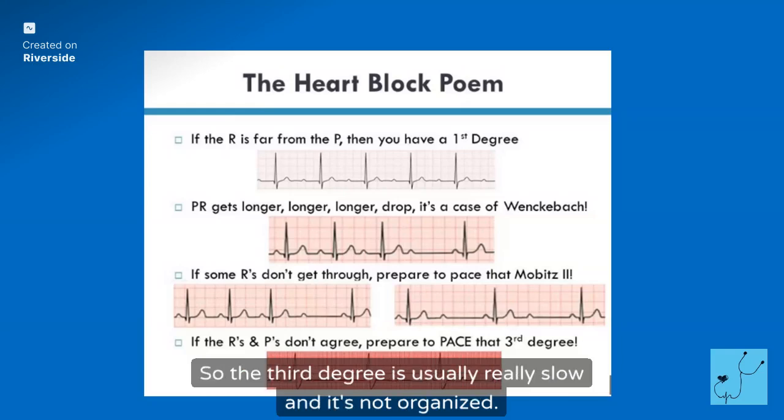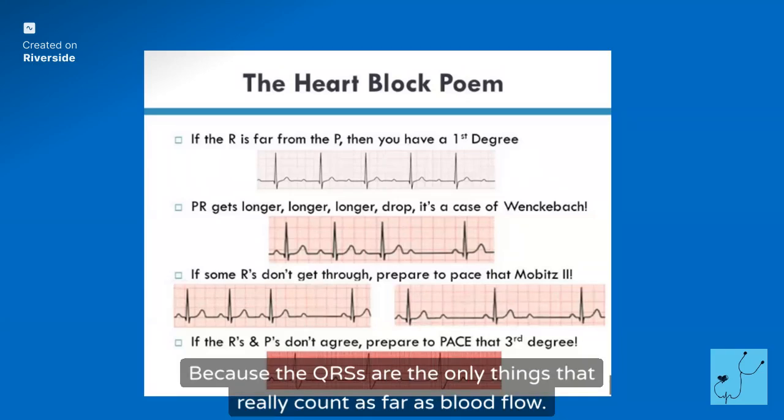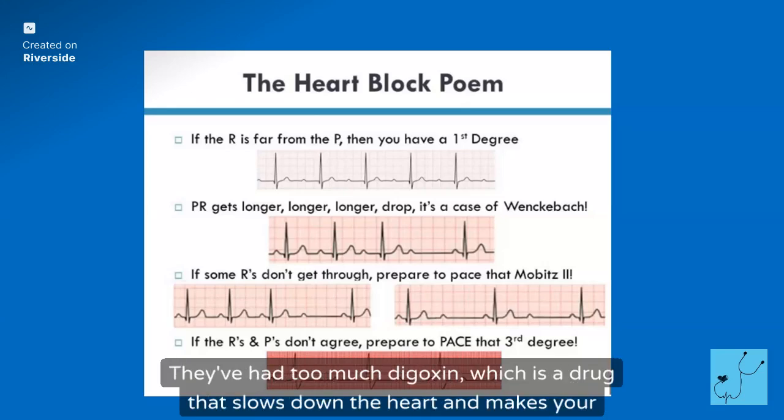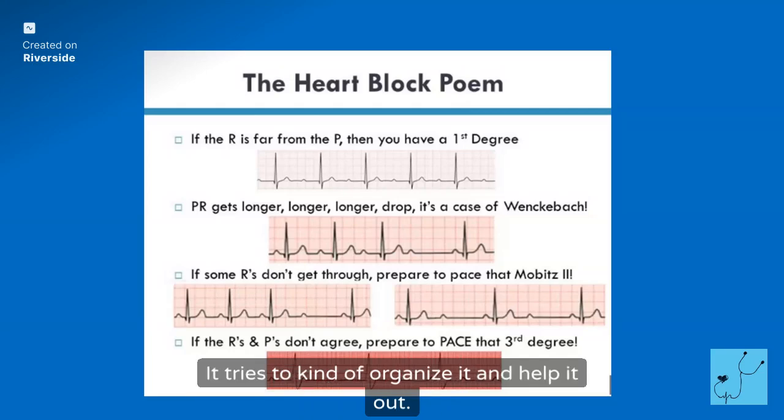So the third degree is usually really slow and it's not organized. So this would be like a heart rate of 30, because the QRSs are the only things that really count as far as blood flow. Okay. People that come in with a third degree heart block, a lot of times they're dig toxic. They've had too much digoxin, which is a drug that slows down the heart and makes your contractions stronger to try to help an irregular rhythm. It tries to kind of organize it and help it out.